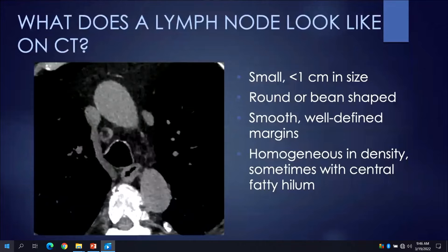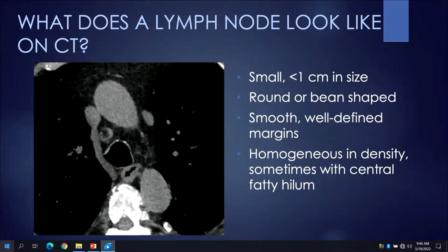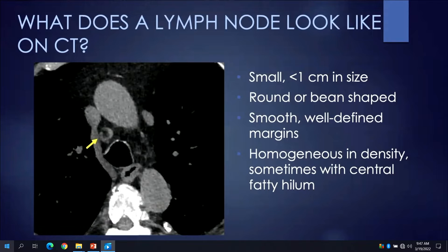What does a lymph node look like on CT? These are small, less than one centimeter structures. Dependent upon the orientation of the CT slice to the long axis of the lymph node, it will appear as either round or bean-shaped. Typically they have smooth, well-defined margins, are homogeneous in density, and sometimes have a central fatty hilum.